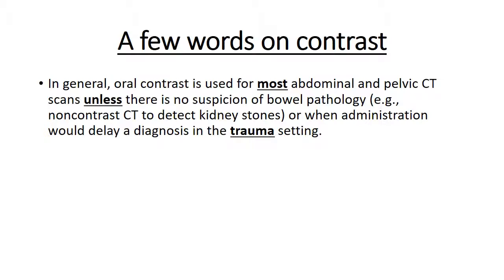You don't do that with kidney stones simply because you're trying to get as good of a look at the ureters as you can to see if there's any enhancing lesions, which would be the stone in the ureter. Contrast within the gut would help mask that finding.